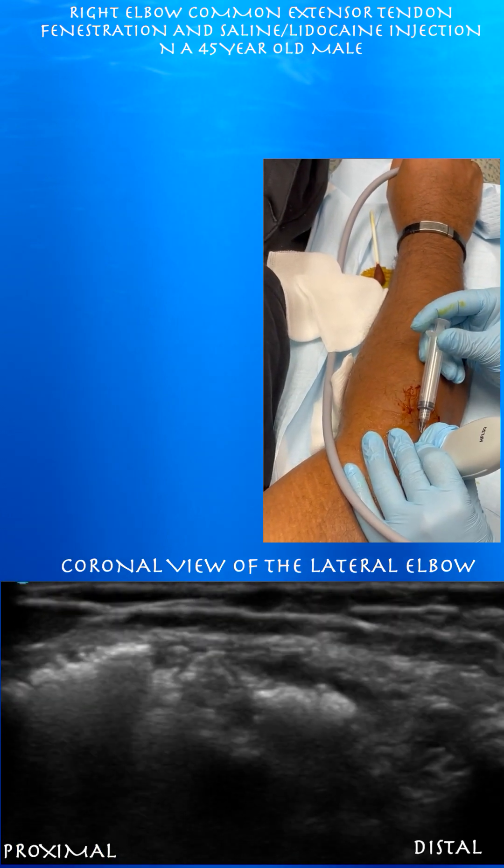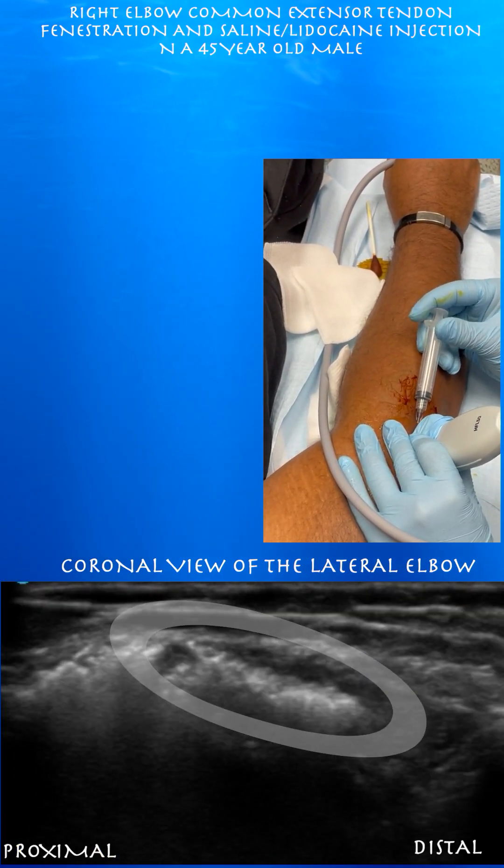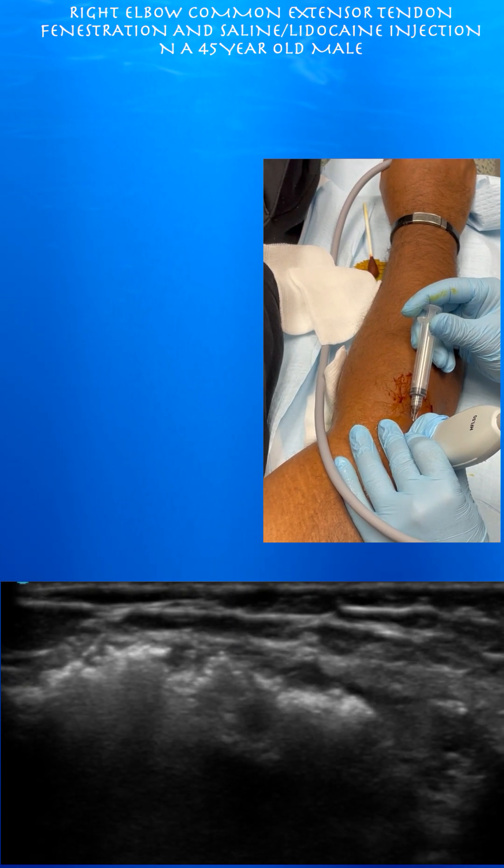Now we're going back to our long-axis view of the needle. You can see all the injectate, which is that bright hyperechoic signal within the tendon — basically some air within the saline and lidocaine that we injected.